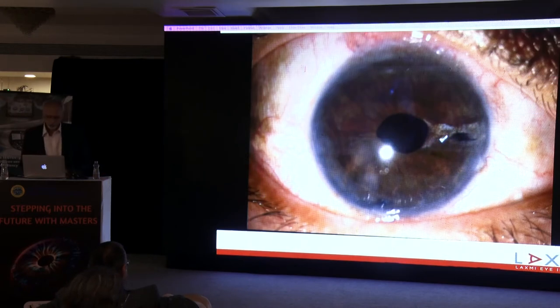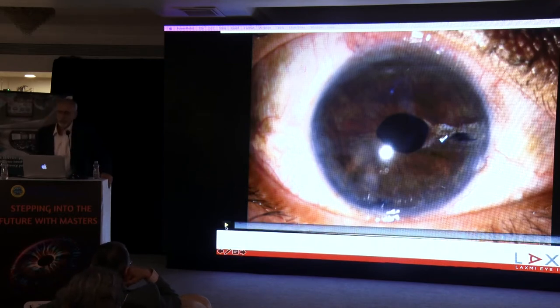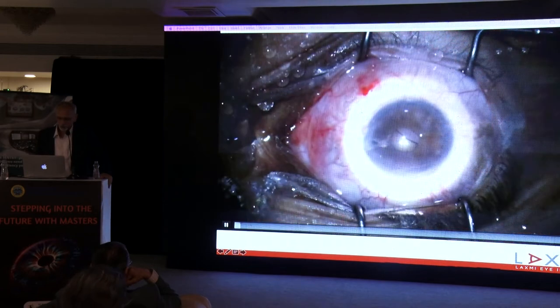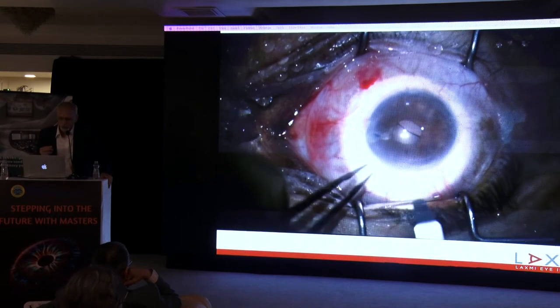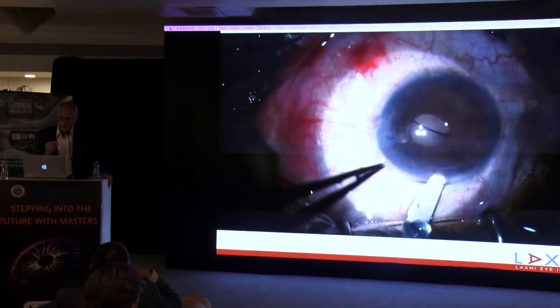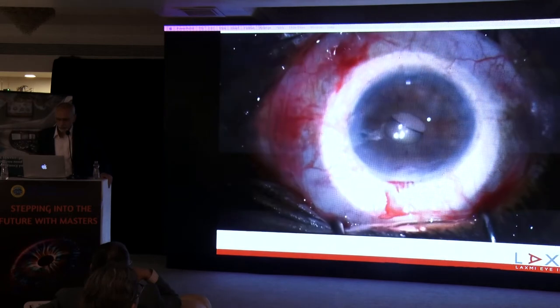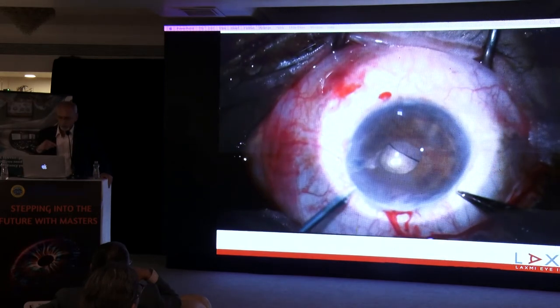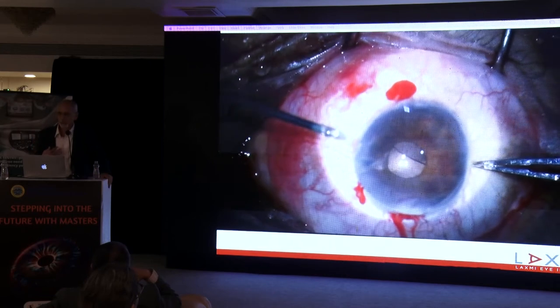This was a patient who called up and said, "Doctor, since today morning, I've suddenly stopped seeing." And he had iris clip in his eye. And when you see through coaxial, you can actually see that the iris clip lens, one enclavation has come out, obviously because you see an iris defect there. The second enclave is strong enough. So what I do here, this I did last week. I haven't seen his results, and he never called up, because he used to call up every day. Since he didn't call, I'm very happy that he must be doing very well.